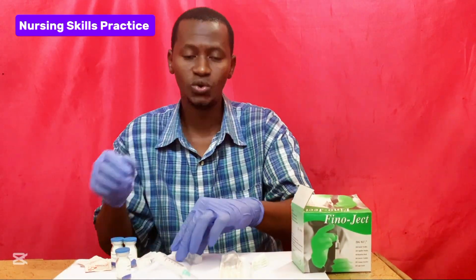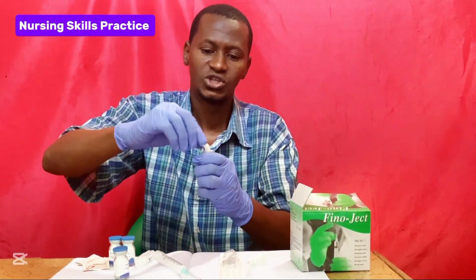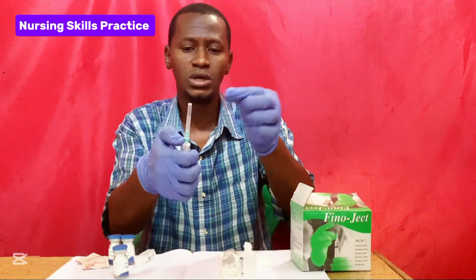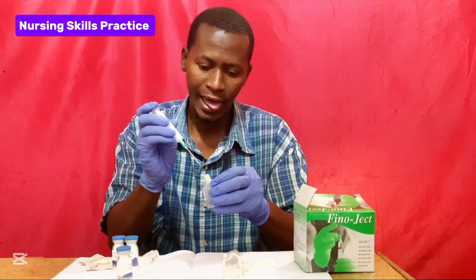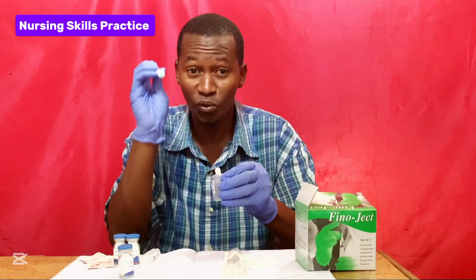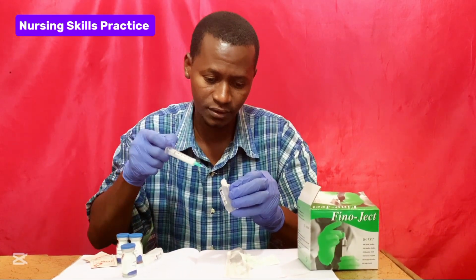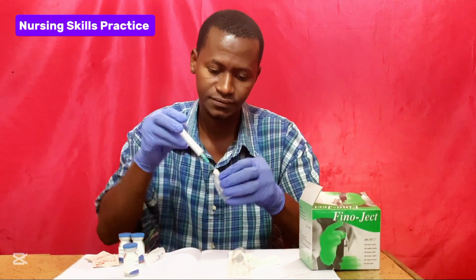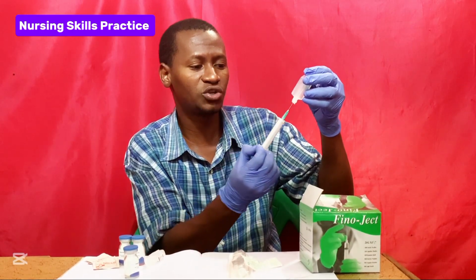Then you get the sterile water for injection and you open it. This is the plastic vial containing the sterile water for injection. Then you remove the cap of the needle first. So I am going to show you how you can dilute the 250 milligram vial powder to be dissolved with 2.4 ml of sterile water for injection. First you withdraw 2.4 ml of sterile water for injection.